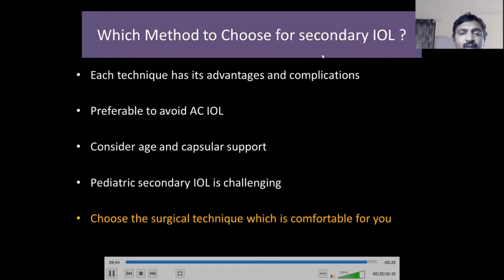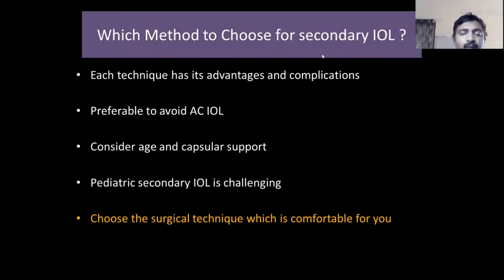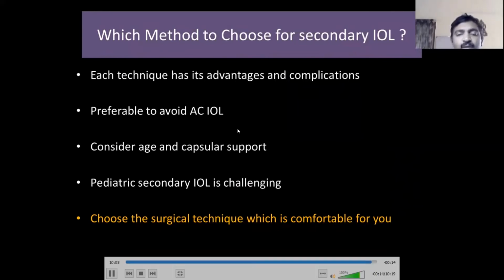Preferable to avoid AC IOLs. Consider the age and capsular support before putting in a secondary IOL. Pediatric secondary IOL is a challenging scenario. Choose the surgical technique which best suits you and which you have learned properly, avoiding any complications.